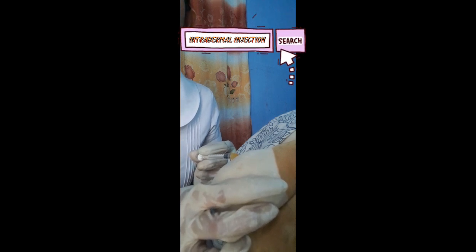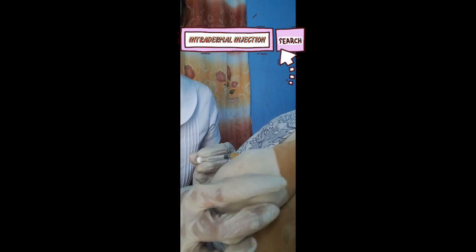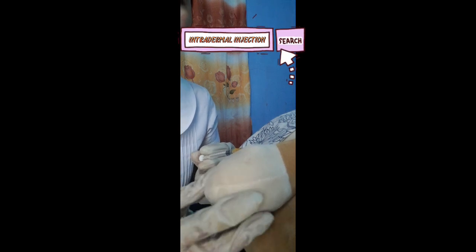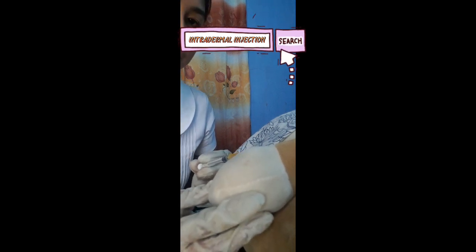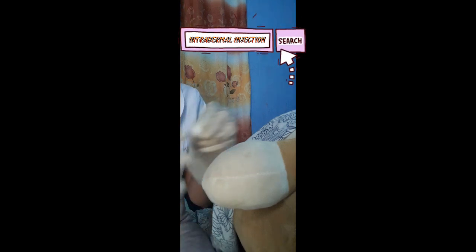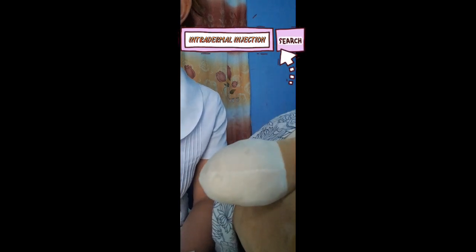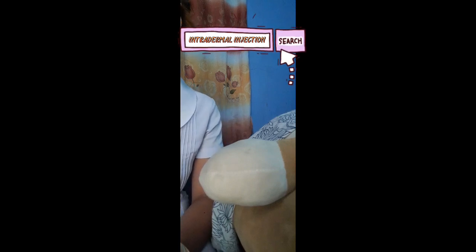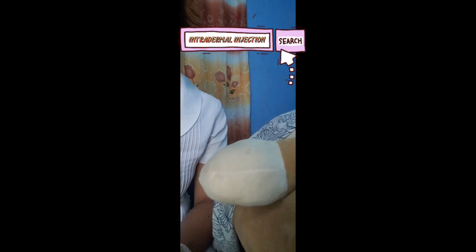Now withdraw the needle at the same angle and pat dry with a cotton ball. Now get the cotton ball dry. So next, encircle the wheal with a blue or black ballpen and instruct the patient not to rub the wheal or erase the mark.